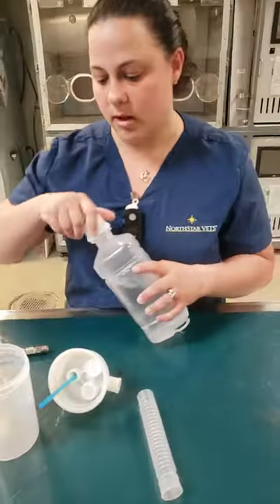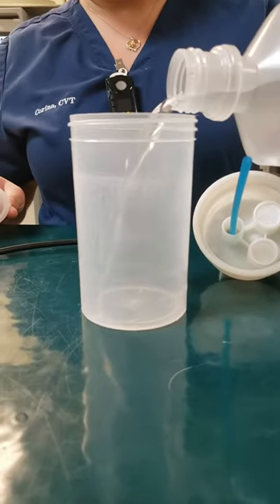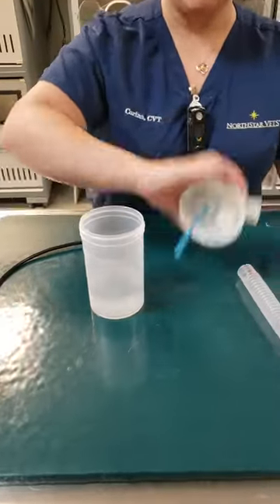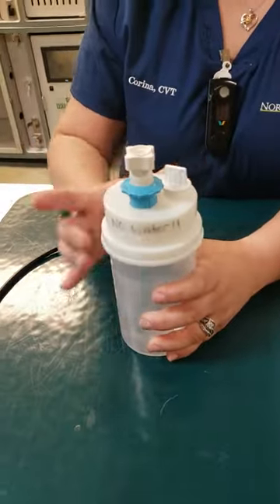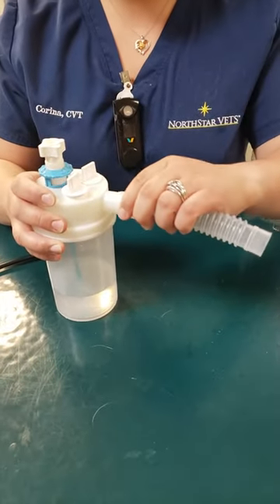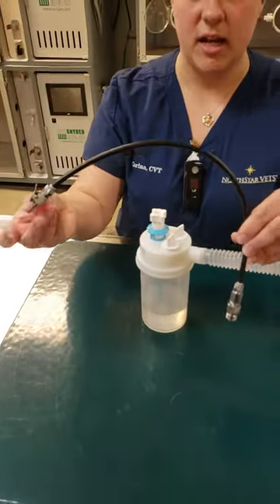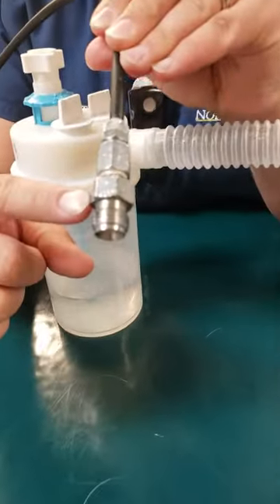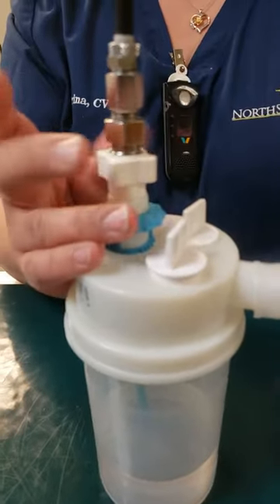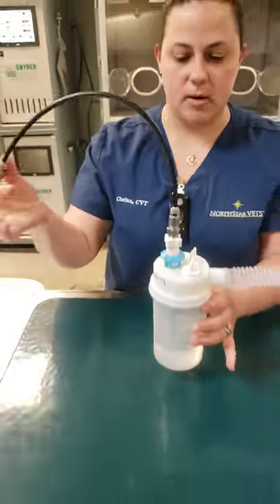What you're going to want to do is pour some of your saline into your canister. We're going to attach our lid and our little tube. The connection that goes into the oxygen cage has two ends — you're going to want to do the screw end into the top of the canister and it just tightens on like so. And then we're ready to hook the unit up to our oxygen cage.